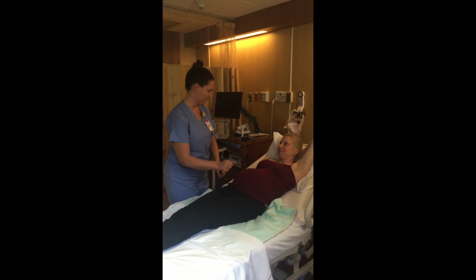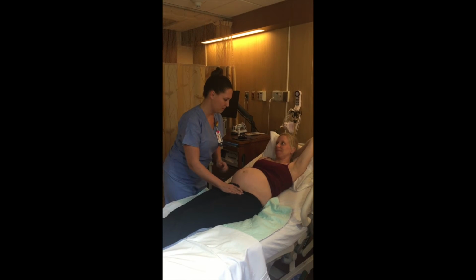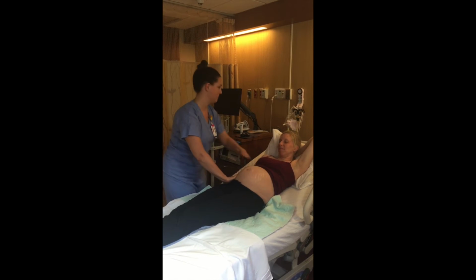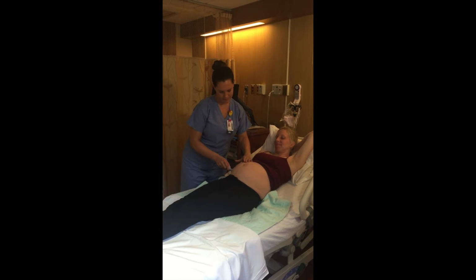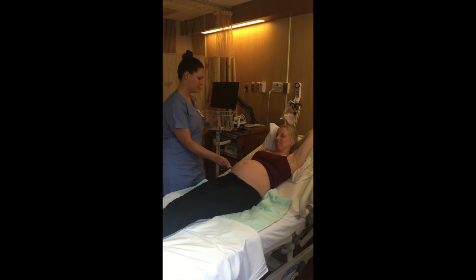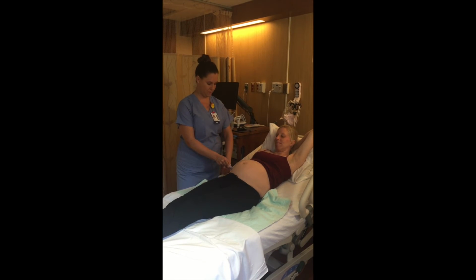First and foremost, I'm just going to lift up your shirt here, Christy, as I perform the Leopold's maneuver. I feel a head. And I feel the fetal back over here. I'm going to now turn on my doptone. I hear a heart rate. And I'm going to now listen for 30 to 60 seconds. And at this time, I'm also going to determine mom's heart rate to make sure that I have both.